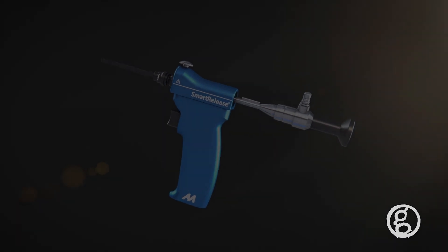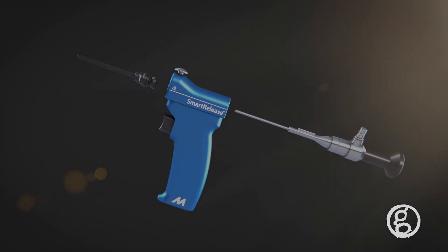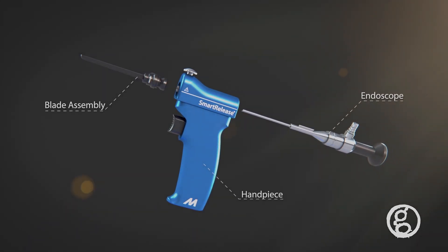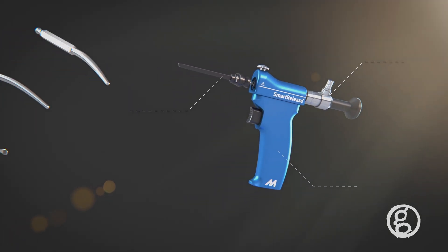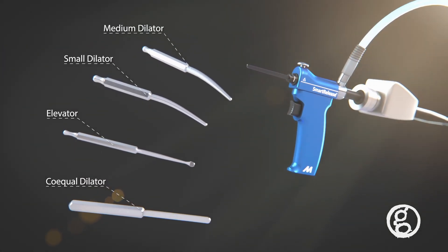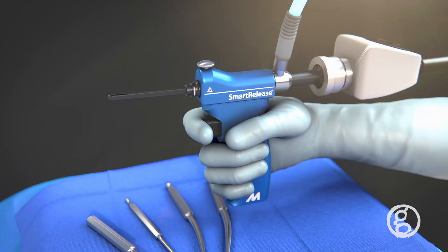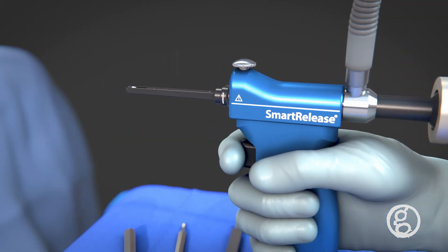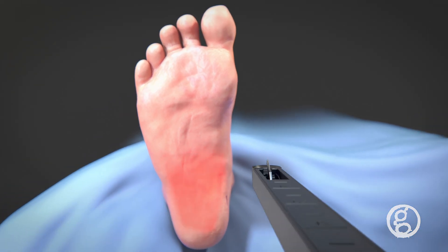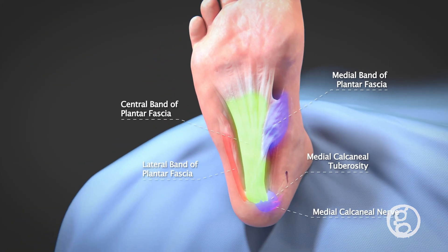The Smart Release endoscopic soft tissue release system is a single portal endoscopic device that consists of a handpiece, endoscope, and blade assembly used to release compressive soft tissue, along with additional instruments to prepare and clear the surgical pathway. The assembled device has a small blade in the endoscopic viewing window that can be elevated and retracted to cut soft tissue to relieve inflammation of the ligament.